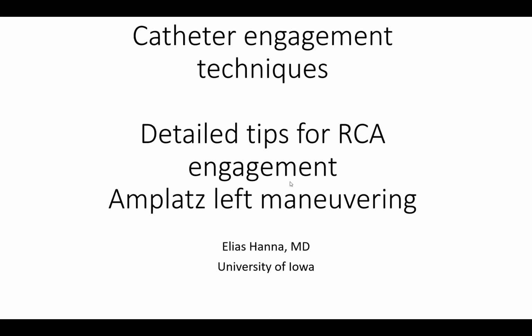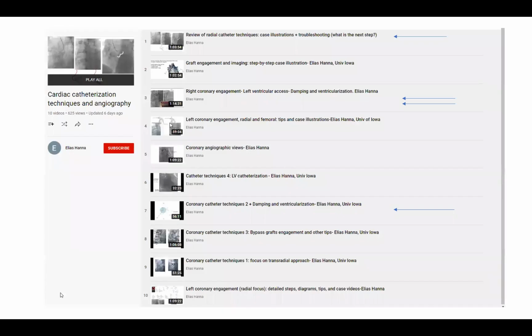So I will talk today about right coronary artery engagement, and I will also give some details about how to maneuver one of the most important catheters in interventional cardiology, Amplatz left. I have provided right coronary artery talks in the past, and I suggest you review those under my YouTube playlist, Cardiac Catheterization Technique, particularly that one here.